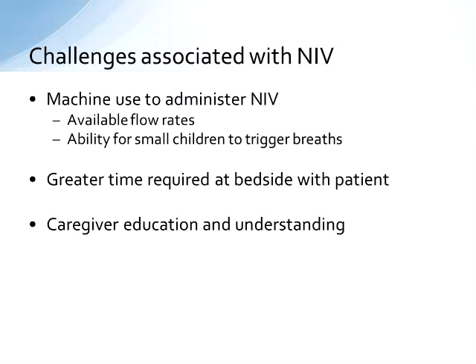I think that this has gotten easier over time as more devices have become available and approved for pediatric patients, and we'll talk about that in a minute. These are more labor-intensive patients. It takes more time at the bedside with the patient to desensitize them to the interface, to get them compliant with the device. There were some studies published several years ago, although they looked at adult patients, but I think that this translates well, and it found that patients, at least within the first 8 hours, are significantly more time-consuming when they're on non-invasive ventilation versus those patients that are intubated.